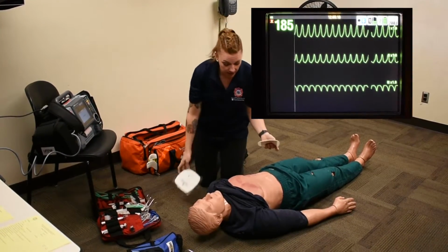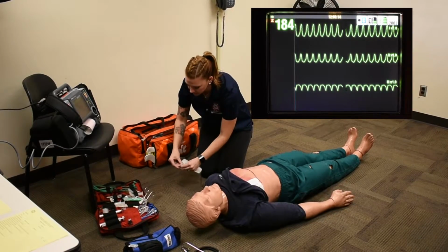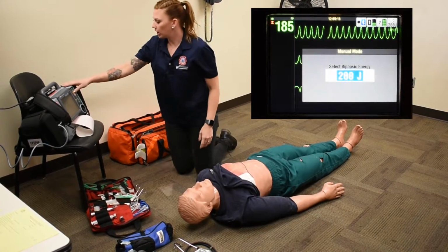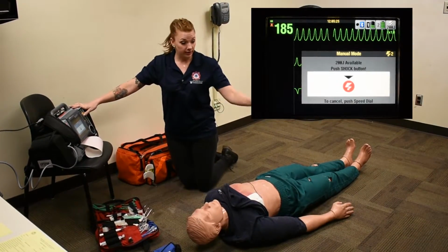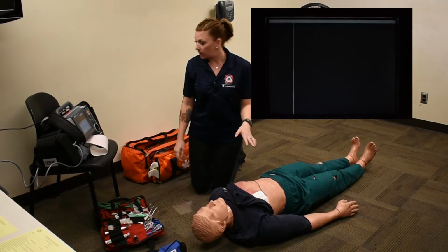So because my patient does not have a pulse, while someone is doing CPR, I'm going to go ahead and put my pads on while we are doing CPR. And then at this time, I'm going to charge and defibrillate at 200, maintaining CPR. Okay, I'm clear, you're clear, everyone is clear. I'm going to go ahead and shock. Continue CPR at this time.